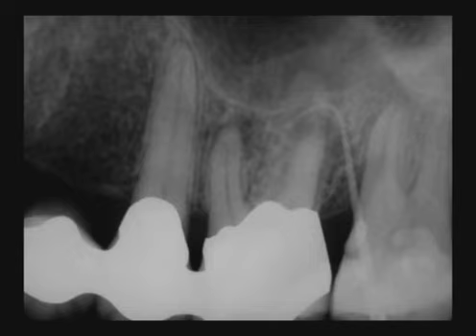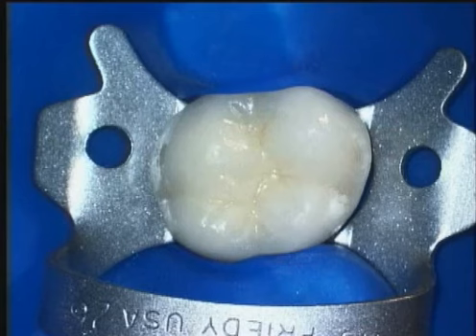This first molar has a sinus tract that is being traced with a gutta-percha point. Notice the crown extends gingivally, and we cannot visualize the pulp chamber. Access cavities need to be well planned so that we can avoid iatrogenic events. We've isolated the tooth, and we're looking at the occlusal view of a porcelain fused to metal crown.